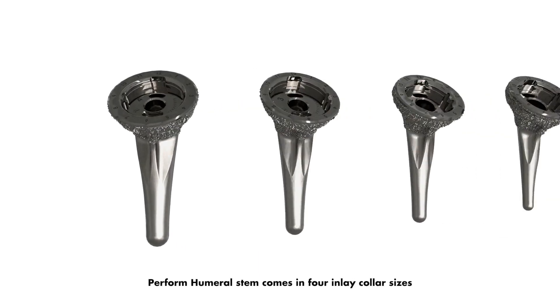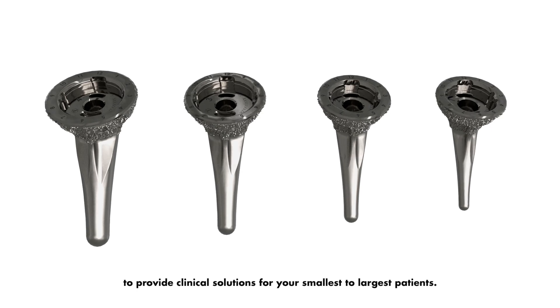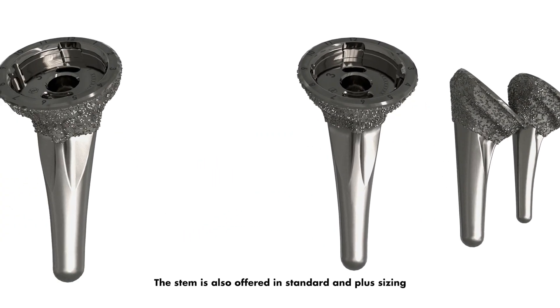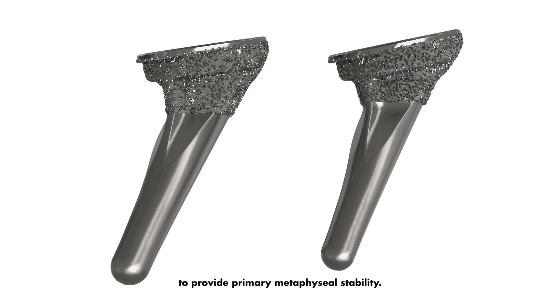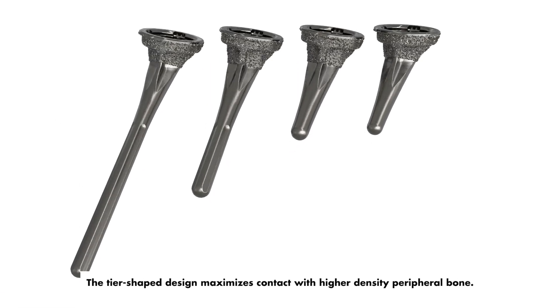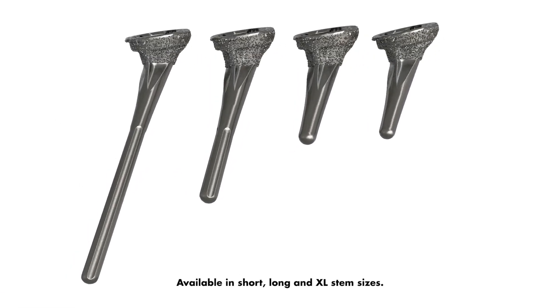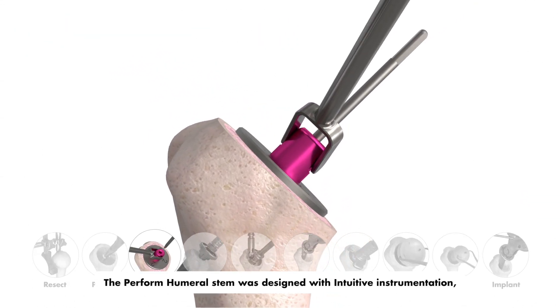The Perform humoral stem comes in four inlay collar sizes to provide clinical solutions for your smallest to largest patients. The stem is also offered in standard and plus sizing to provide primary metaphyseal stability. The tear-shape design maximizes contact with higher-density peripheral bone. Available in short, long, and XL stem sizes, the Perform humoral stem was designed with intuitive instrumentation.